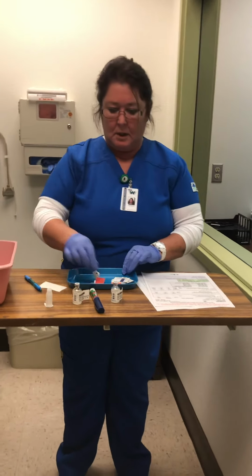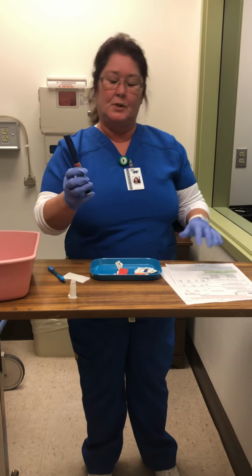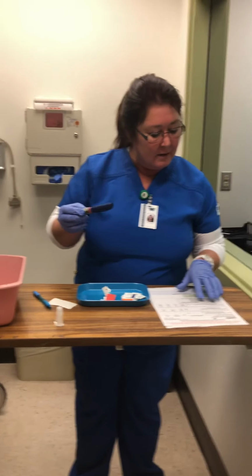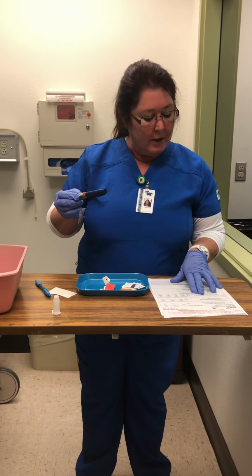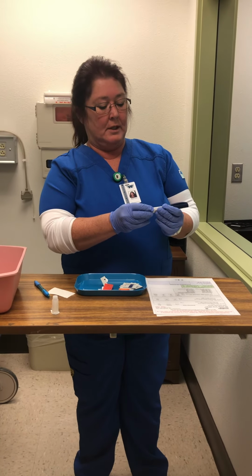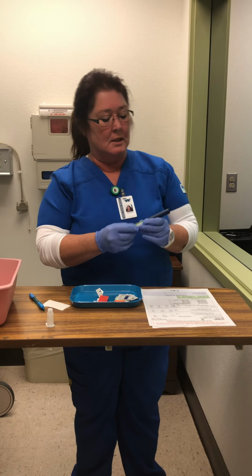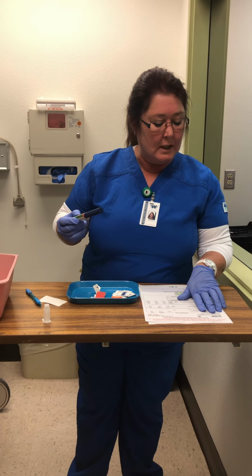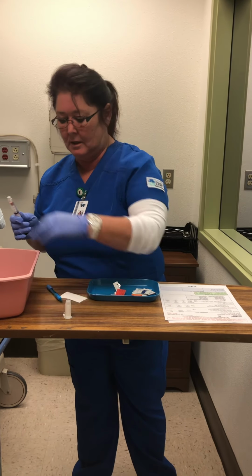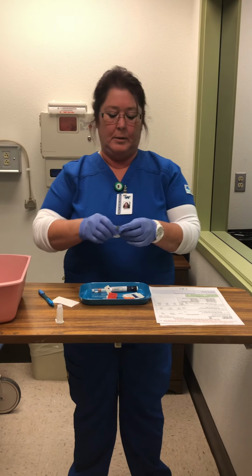Okay, so next, put those back. Next, I'm going to get my insulin pen. I'm going to verify again that I have the Lispro U100 insulin pen, and I have the Practi Insulin Lispro U100, and it has Shirley Cost, 5/14/1964. I'm going to take the top off of this, and I am going to clean this with an alcohol pad.